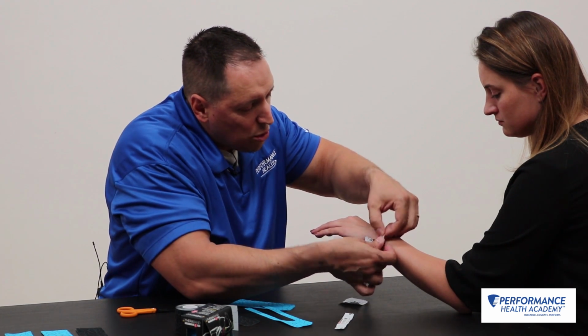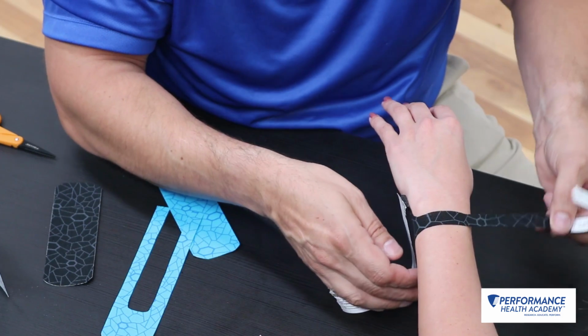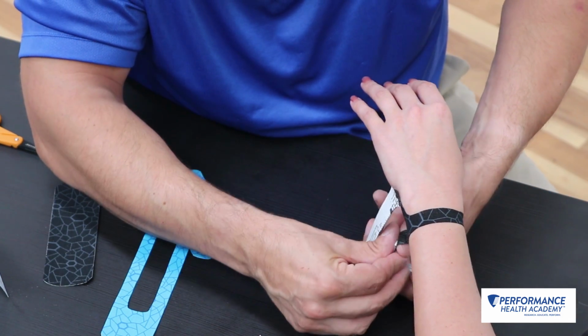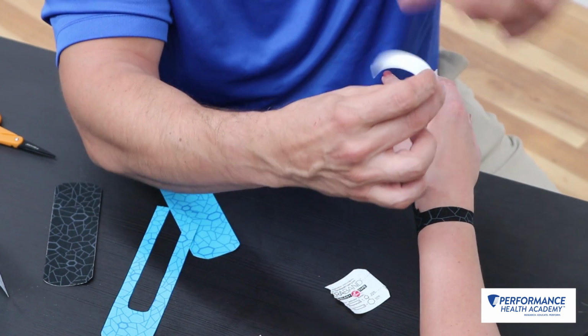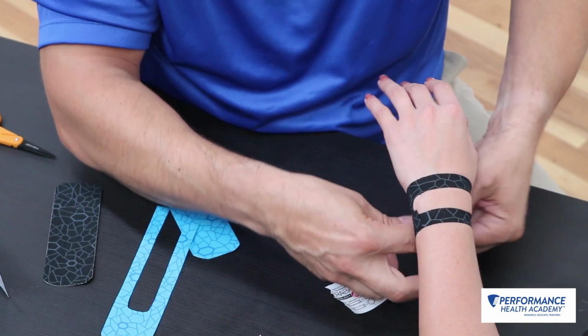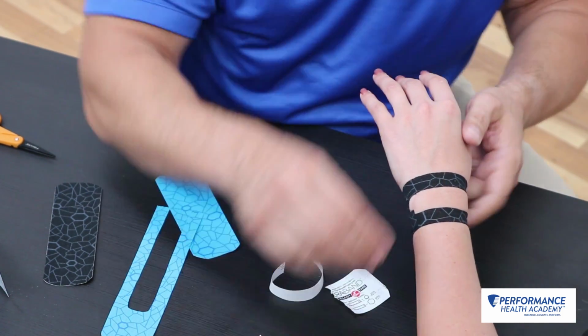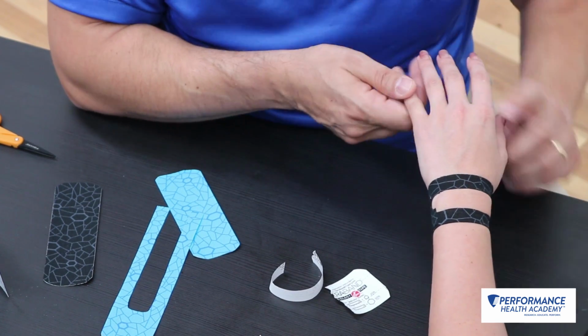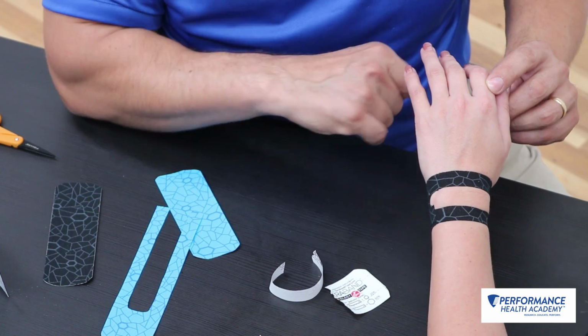Then what I'll go ahead and do is about 50% support, based on what you're trying to achieve. Wrap that around one piece. 50% support distally. You want to make sure not to get it too tight. All we're looking for is some distal radial ulnar joint support. That's the first portion of that. If that stabilizes the ECU tendon or decreases pain, you're good.